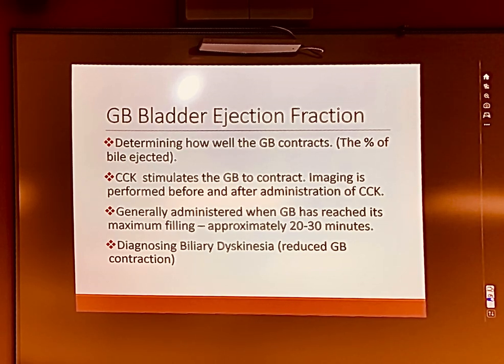Or 24, depending. We have had patients that have had very markedly elevated bilirubins, 10, 12, right? They look like a big bird. So we give them 10 millicuries and then we scan them the next day. We don't even bother because we know we're not going to see anything. We inject them on the floor and we bring them down at 24 hours to see what we see.